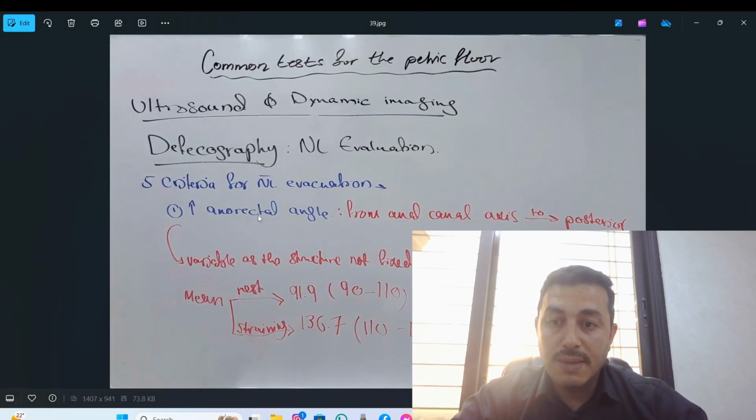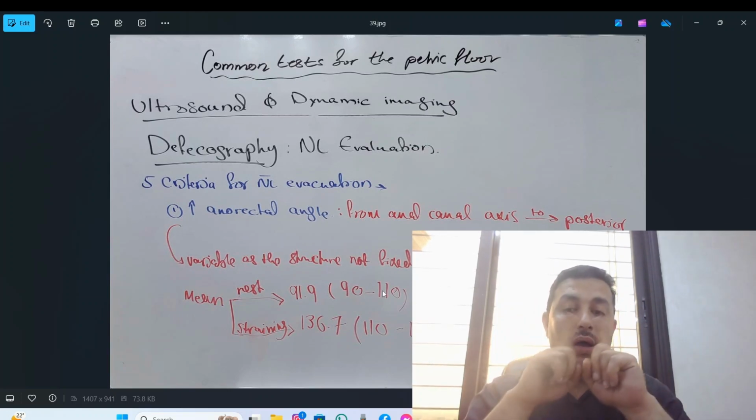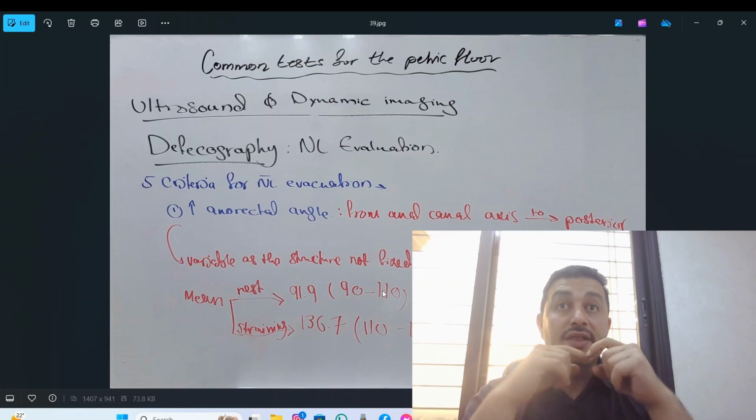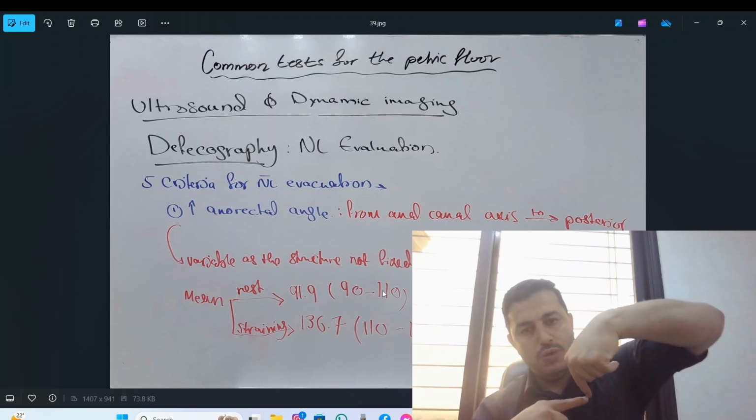Okay, we talked about the anorectal angle and we said the measurement of the anorectal angle at rest should be smaller.